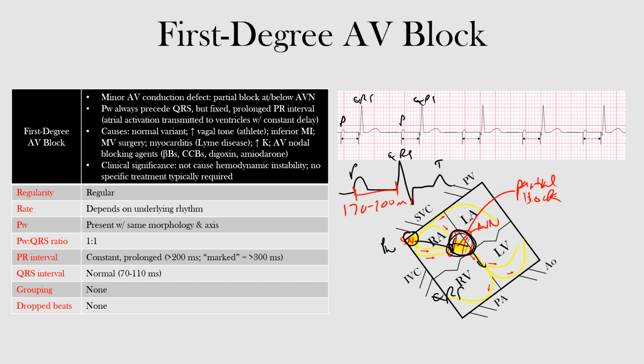In this case, notice where it's starting from this point until here. It's well beyond, at least one small box beyond one of those thick lines. Remember, from one thick line to the other represents 200 milliseconds, so you can use that as your cutoff. And here we can clearly see that it is prolonged throughout all of these.